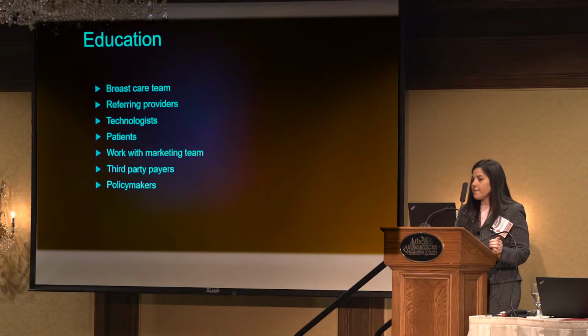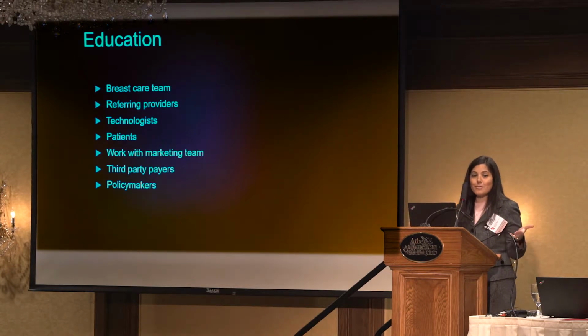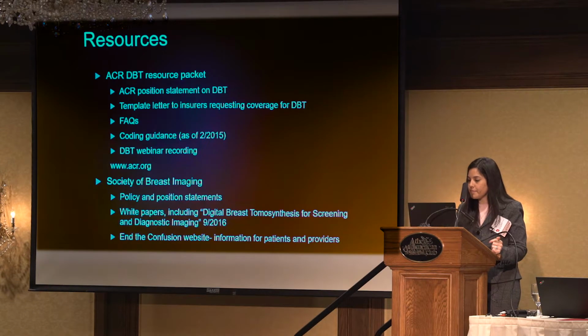We found that actually physically meeting with referring providers helped. There were actually some primary care providers that told me to my face, oh, well, tomosynthesis is just a money-making scheme for radiologists. No, but here, let me show you some images. Let me show you why it's better. Let me show you why it's not perfect, why we can still be fooled, why you can still have a recall, even though it's a DBT study. But also, let me show you why it's much better than a 2D mammogram. And really taking that time to sit down with those providers, having a lunch and learn session has paid off.